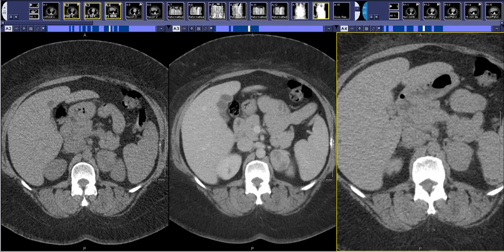So I'll tell you that the usual indication for this is to definitively characterize an adrenal mass. Adrenal nodules and masses are very commonly incidentally detected on CT scans, and without doing a biopsy, frequently we can characterize them using this. The other way you can characterize an adrenal nodule or mass is with an MRI. I'll tell you a CT with washout is a little bit more sensitive for especially lipid-poor adrenal adenomas, and so it's a little bit more sensitive test.